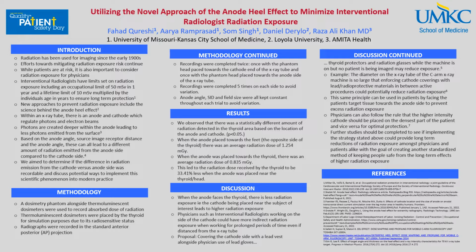Further studies should definitely be completed to see if implementing the strategy that we have proposed could help provide long-term reductions of radiation exposure amongst physicians and possibly patients alike, with the goal of creating another standardized method of keeping people safe from the long-term effects of higher radiation exposure, especially over a prolonged period of time.